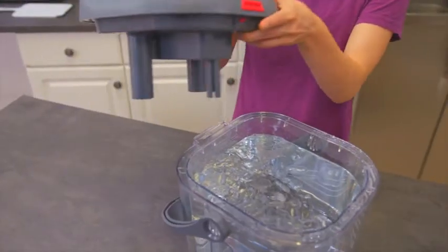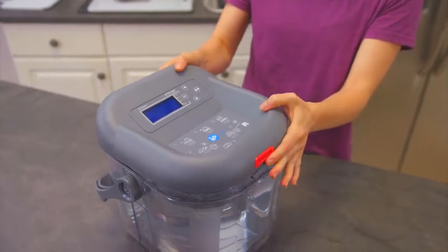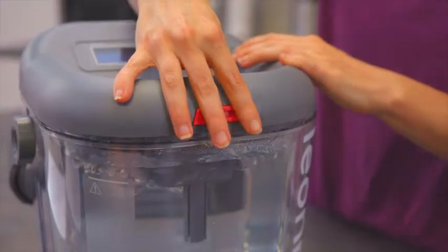Once you have added the ice, attach the lid. To attach the lid, angle the lid so the back is in place, and then click on the latch at the front.